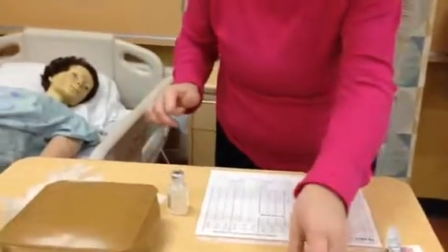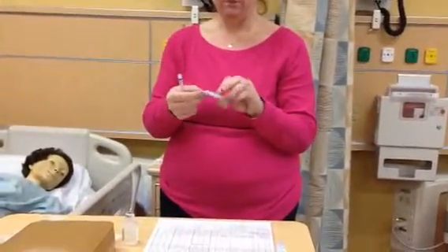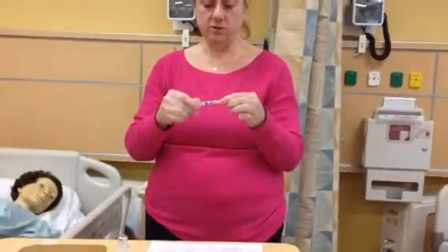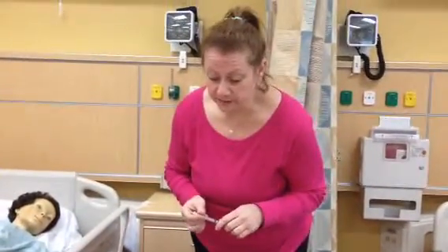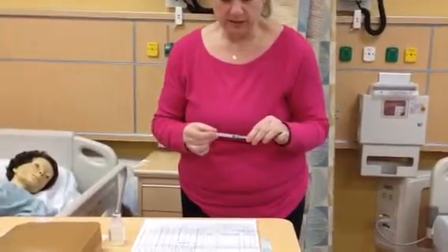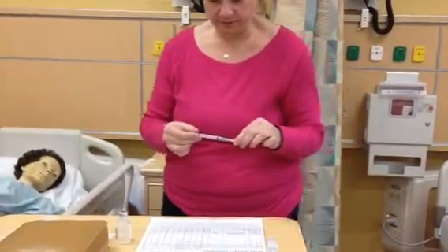I'm going to use a 3 milliliter syringe and a 23 gauge needle. I will twist this on like so. So this is a 50 milligram per 1 milliliter bottle of a dose. So I will be using 1 milliliter to administer for her.